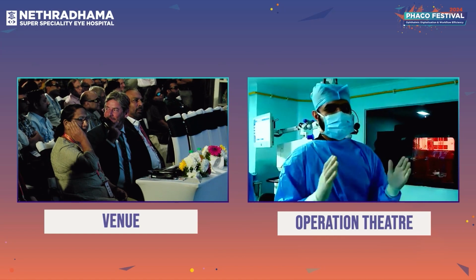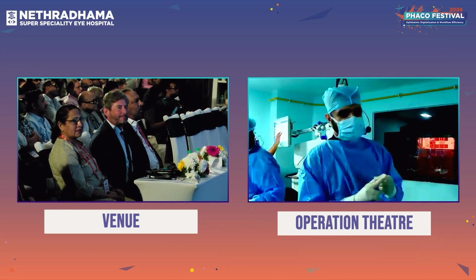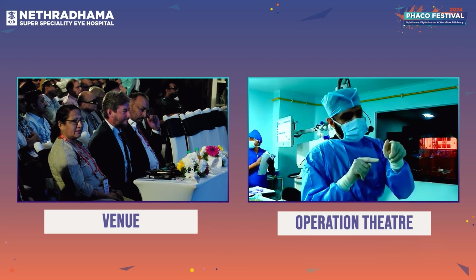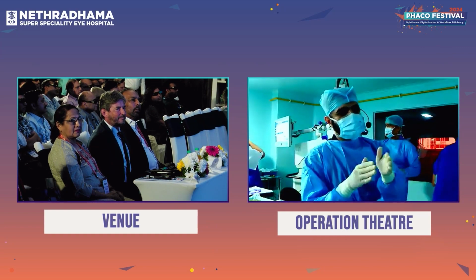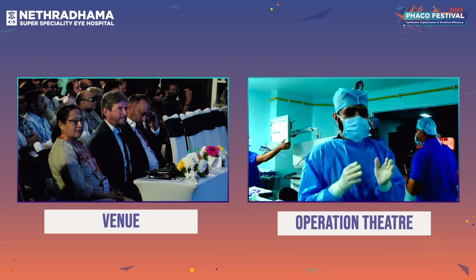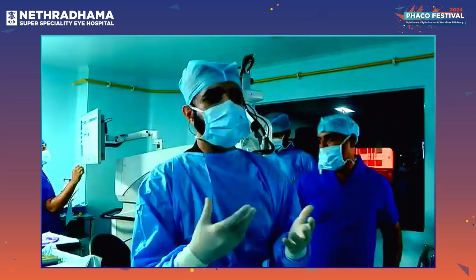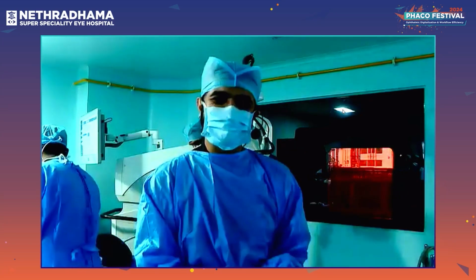The key is, the whole point is there are two things in handling these kinds of hard cataracts. First, when you chop, if you observed, I didn't go too deep. When you chop, you don't need to go deep. When you separate, while you're separating, you can go deep. That's one very important thing. The second thing is small pieces. Always target small pieces. It becomes so much easier for your phaco machine to eat. Suddenly it starts behaving as if it is NS2 grade. So it's important to remember these two points in handling these kinds of cases.